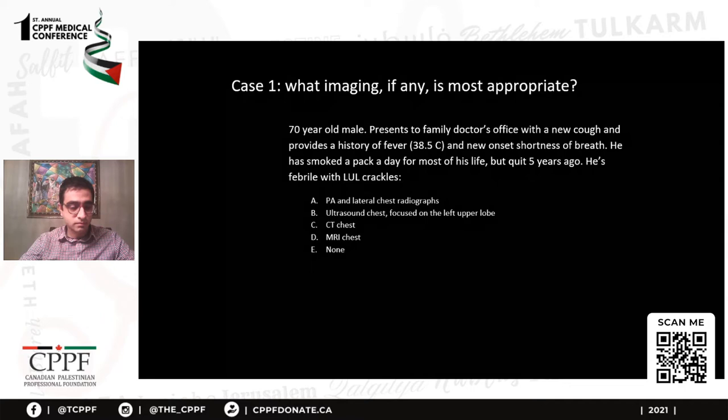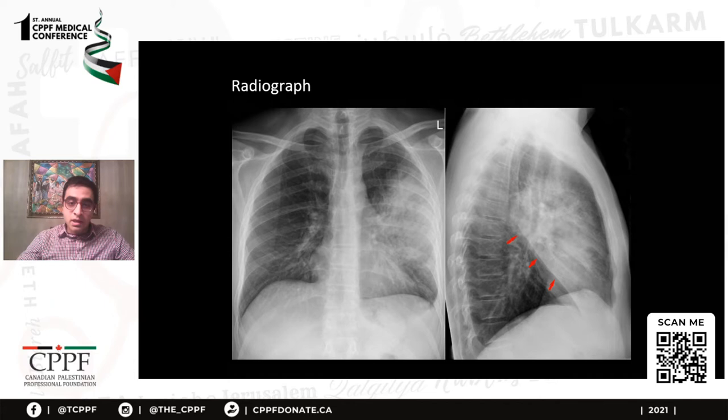All right, so time is up. The correct answer in this case would be PA and lateral chest radiographs. So you do the radiographs, and this is what you find.